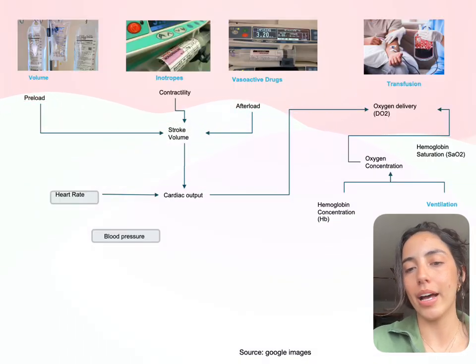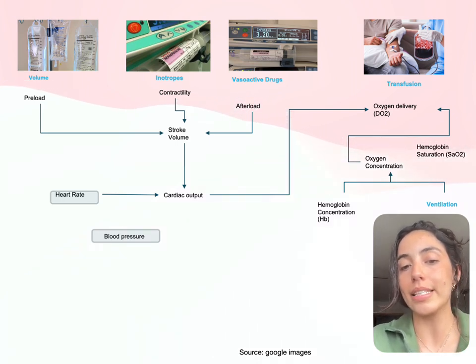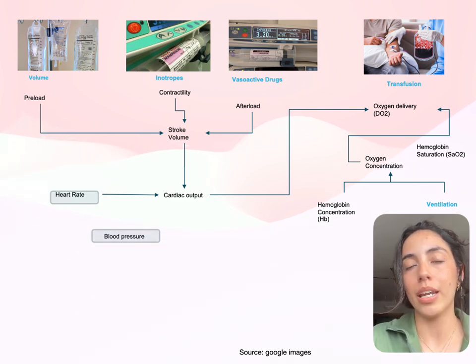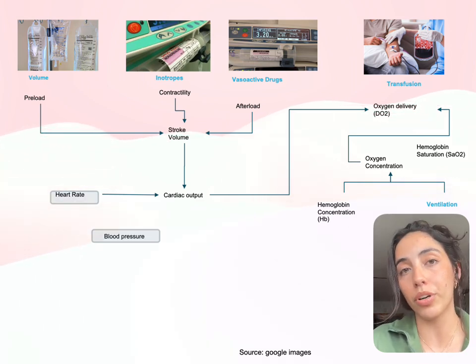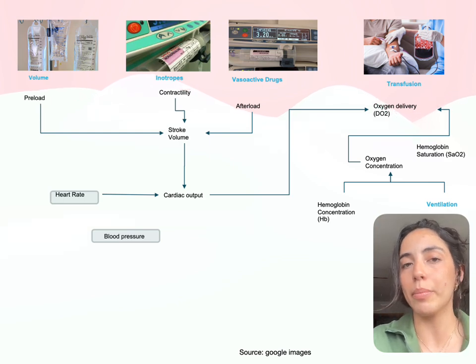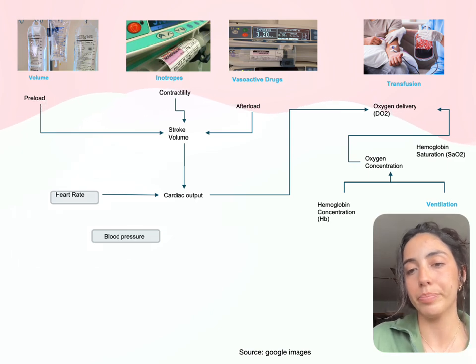Over here we see a little quick reminder from past classes in which the different variables that we can gain insight into in a patient's hemodynamic status will directly reflect what the treatment that they need is, in a way that is a lot more tailored, and that doesn't imply using, for example, inotropes if a patient is only suffering from a volume issue. Sometimes the treatment algorithm that we follow is very broad in the pharmaceuticals that we prescribe, and this can allow us to be a little bit more tailored and see the response that a patient has to specific treatments over time.